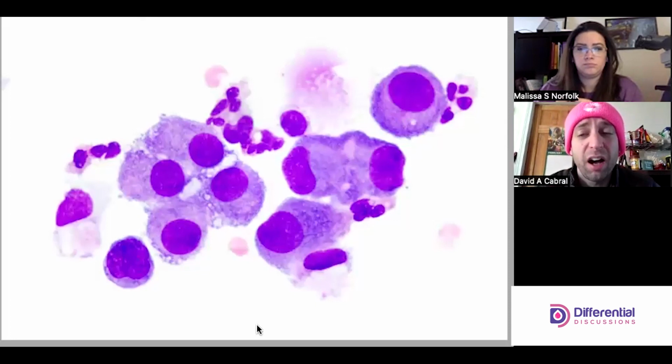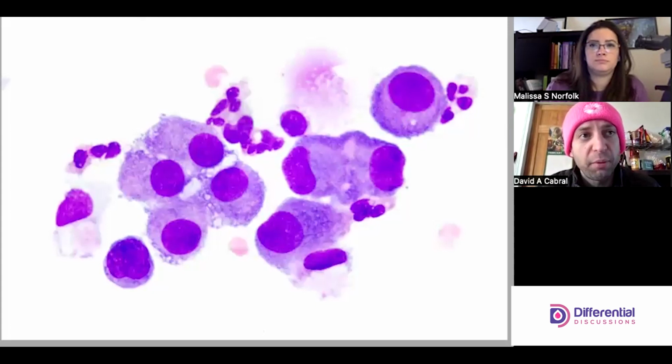And then the biggest thing, honestly, is that the chromatin pattern is totally inconsistent with a plasma cell. I try to hit the easy things first because chromatin is really tricky. At the level where you as a morphologist are looking at chromatin in a thoughtful way, that's a high level of competency. But the chromatin pattern on mesothelial cells is such that I don't want to say they're immature looking, but they never look fully mature in the way that hematopoietic tissue, when it matures, is clumped.